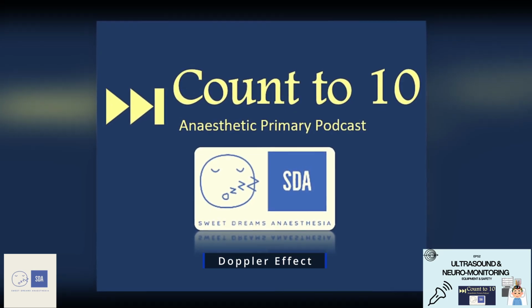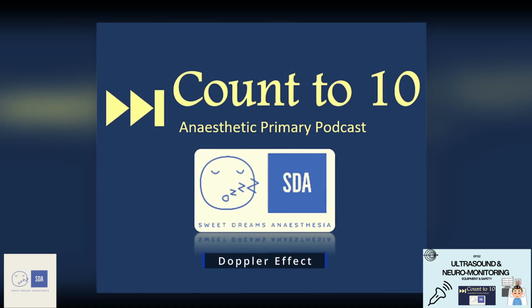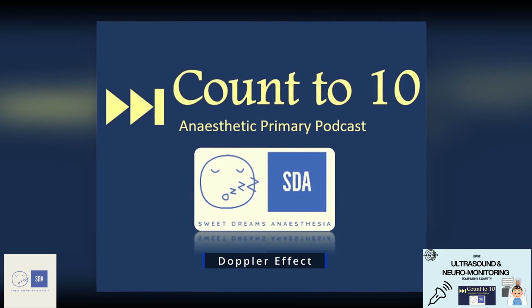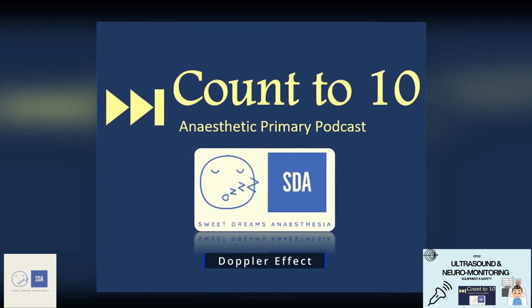And knowing that the frequency and the wavelength change relative to the receiver, we can then manipulate that within the ultrasound to give us information. Specifically with Doppler mode, we can use the change in frequency of blood traveling across the ultrasound beam to figure out 1, which way the blood is moving, and this is referred to as color flow Doppler, and 2, to do higher level calculations such as figuring out cardiac output, quantifying valvular disease, and the basis of all these calculations comes from an equation which we refer to as the Doppler shift equation.